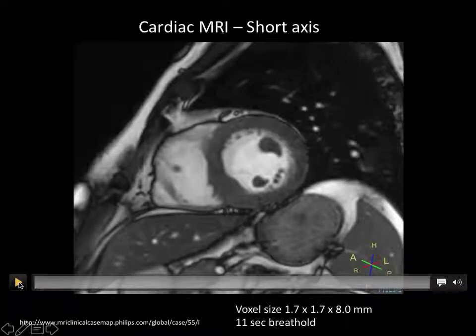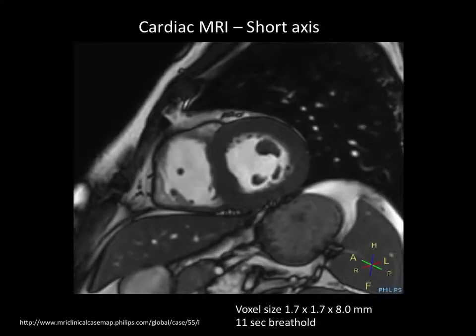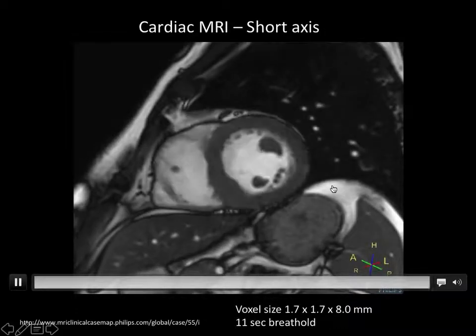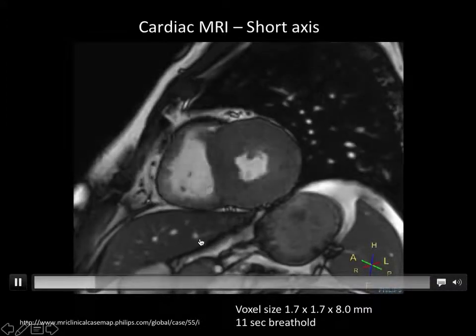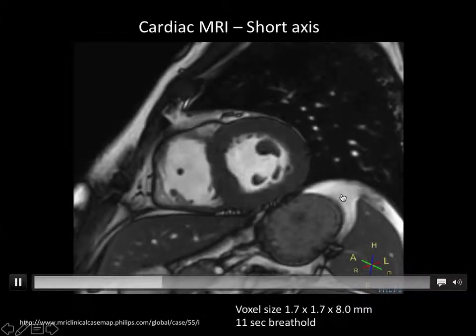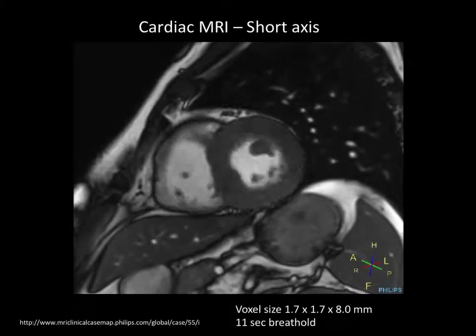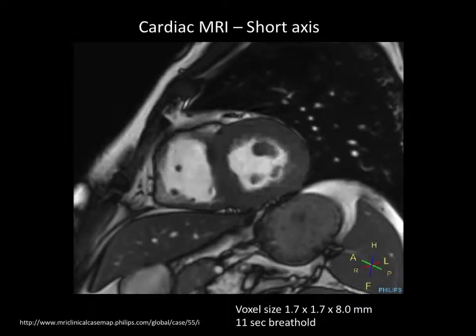All right. So MR function, if you get someone to hold their breath, which this person is doing, because you can see their diaphragm is not really drifting one way or the other, it's in a fixed position, and all of these surfaces are pretty well in a fixed position. This is their liver, their stomach, interstitial fat. These are vessels in the lungs. So you get these tremendous pictures if someone can hold their breath. And this would be acquired over about 8 heartbeats, something like that.